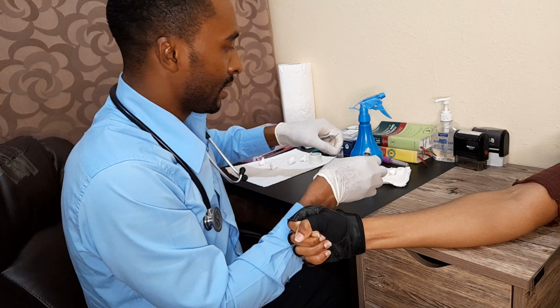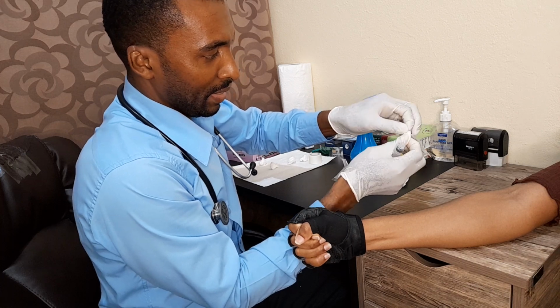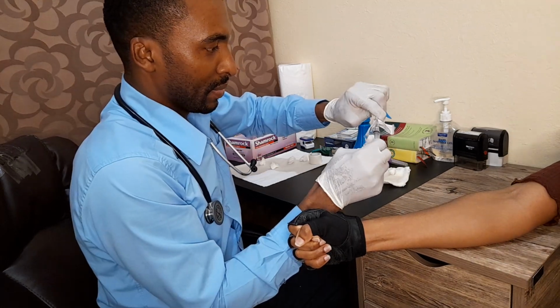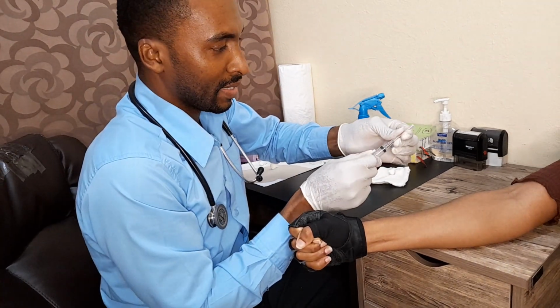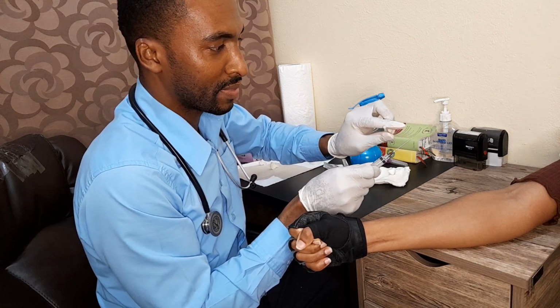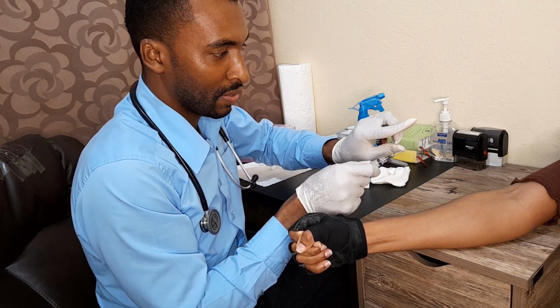All right. So as you can see, when you're opening these instruments, we have a lip here, and we just pull it and open it. So we try and keep it as sterile as possible. And we put the needle and the syringe like this, right? Another technique that I use is to pull the cap a little to have an idea which side the bevel is, because at all times when you're taking the blood, we should always aim to keep the bevel up.